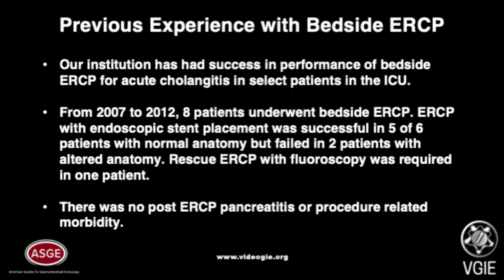Our institution has had success in performance of bedside ERCP for acute cholangitis in select patients in the ICU. From 2007 to 2012, 8 patients underwent bedside ERCP. ERCP with endoscopic stent placement was successful in 5 out of 6 patients with normal anatomy, but failed in 2 patients with altered anatomy. Rescue ERCP with fluoroscopy was required in 1 patient. There was no post-ERCP pancreatitis or procedure-related morbidity.